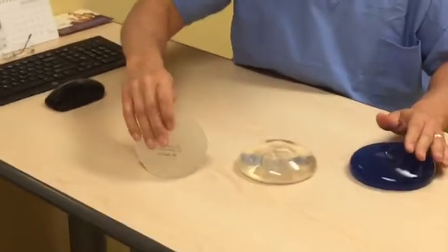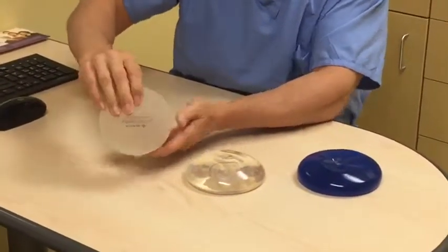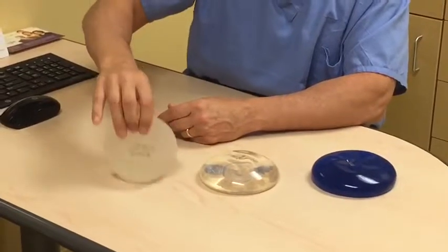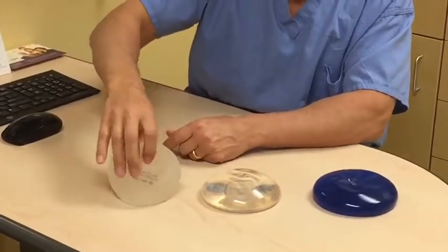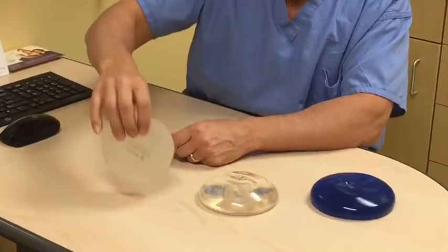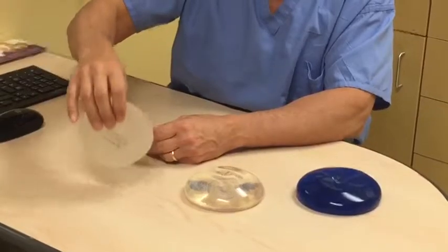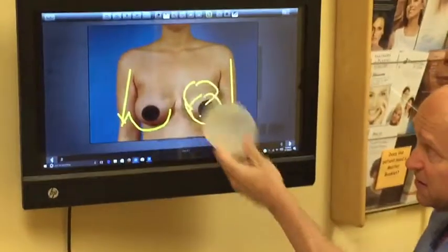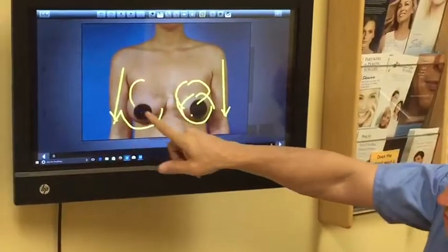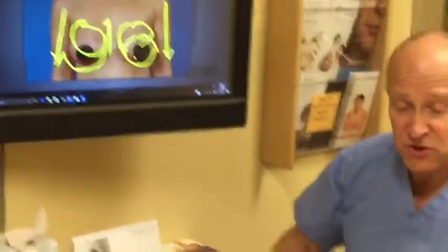Even better is a cohesive anatomic gel implant. Because the gel is a little bit stiffer inside, when this is directed downward, there's hardly any force at all felt on the bottom part of the implant. So that when this is put in, there's no force present on the bottom part of the breast, and therefore you see very little bottoming out with this type of device. So when this kind of implant is put into the breast, it will stay right where you want it. It will stay up, so it will create the pleasing breast shape.